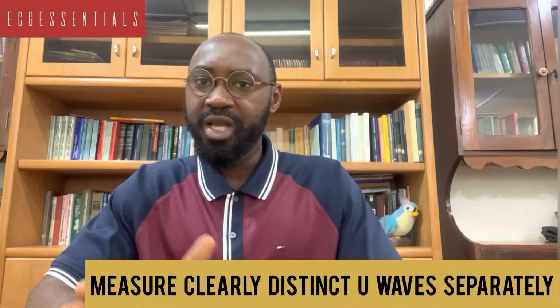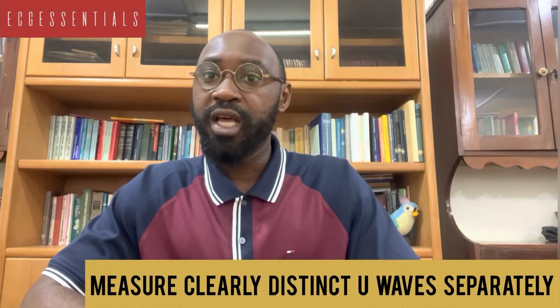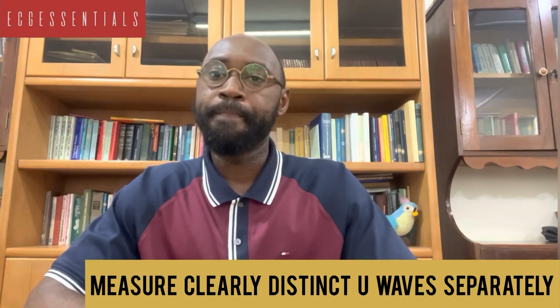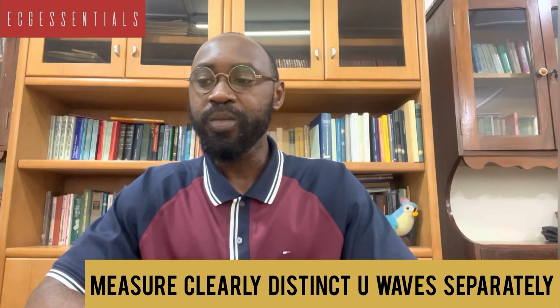When we are trying to measure the QT for U waves that appear fused to the T wave, not very distinct from it, you have to measure that as included in the whole interval. But for those U waves that appear clearly distinct from the preceding T wave, those ones should not be included in the measurement. All right.